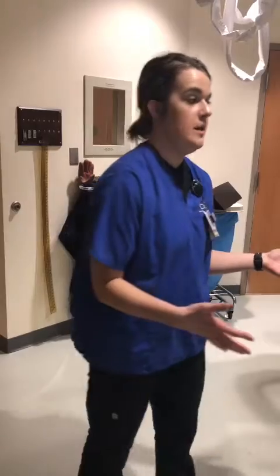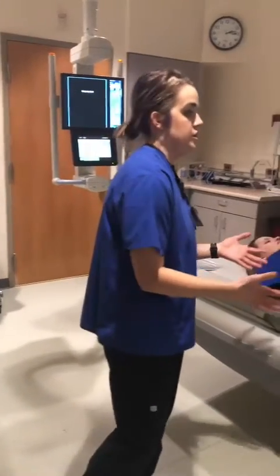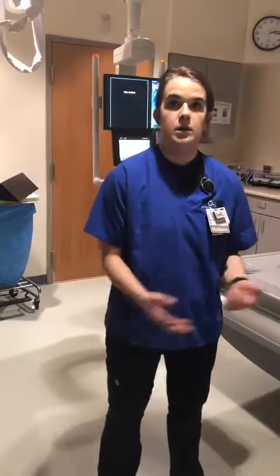I'm going to check to make sure that there are no artifacts, no metal, buttons, zippers, anything that could be in the way of the anatomy that I'm imaging. And then the last thing is I'm going to change the patient into a gown if there is any metal, zippers, buttons, anything. But in this case, my patient does not have any reason to be changed into a gown.